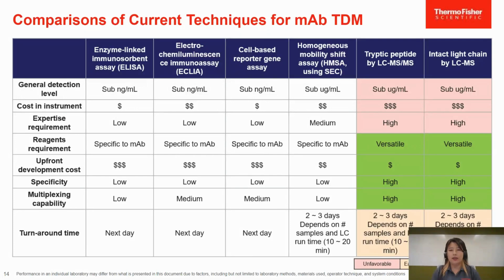For the mass spec, the cost of the instrument is relatively expensive compared to the other assays, and they also require high expertise to operate the system.